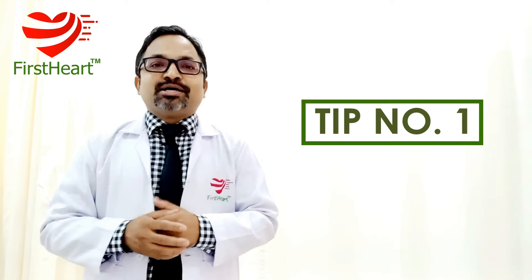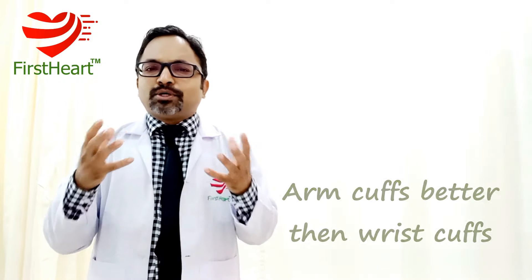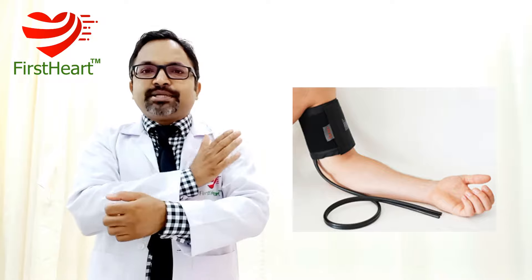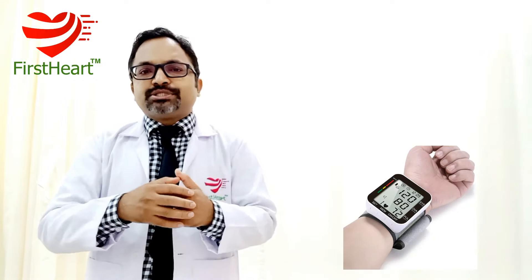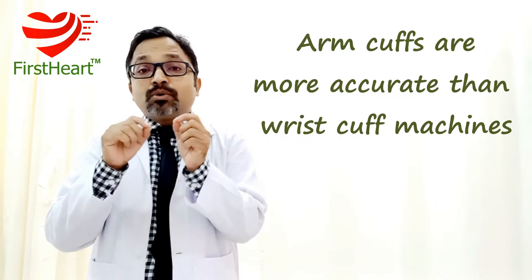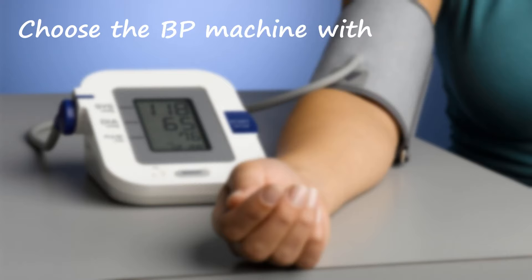Tip number one: choose the BP machine with a cuff which needs to be tied to the arm. The cuff is the rectangular band which needs to be tied to your arm. In the market, there are two types of BP machines available — one with a cuff tied to your wrist and another with a cuff tied to your arm. BP machines with an arm cuff are more accurate than those with a wrist cuff. So choose the BP machine with an arm cuff.